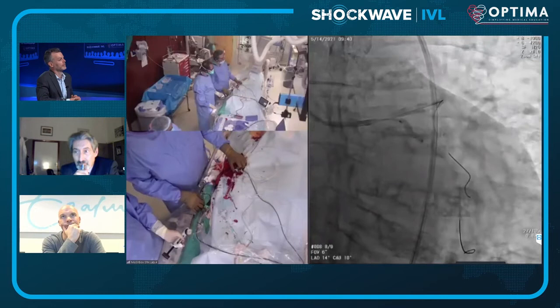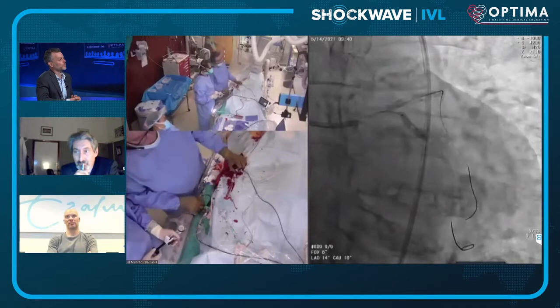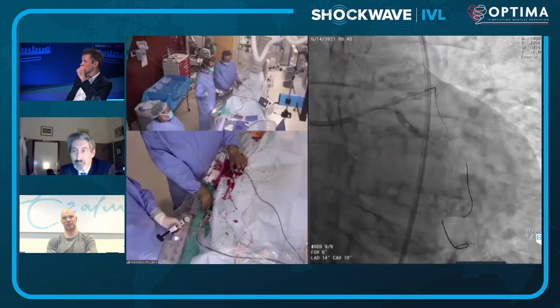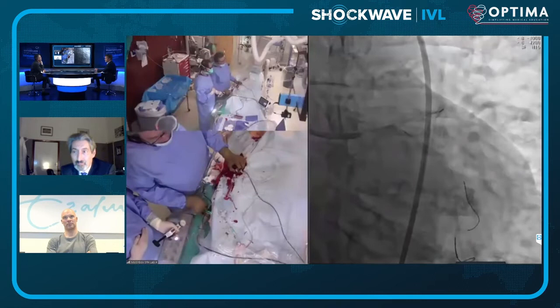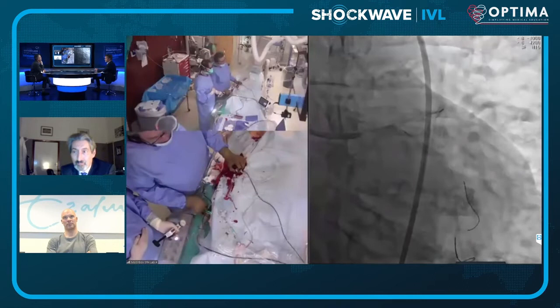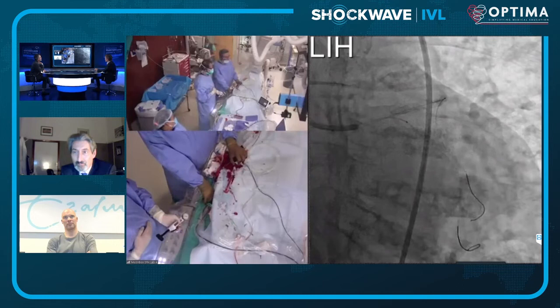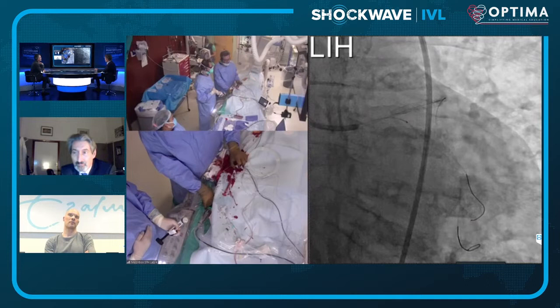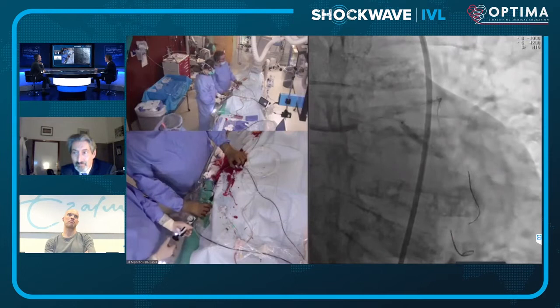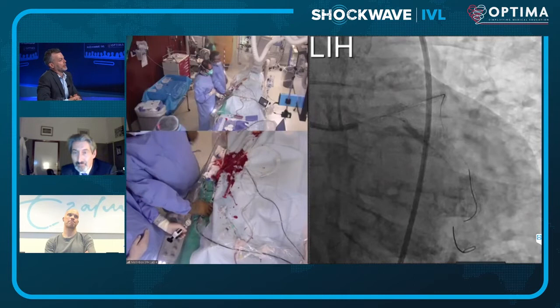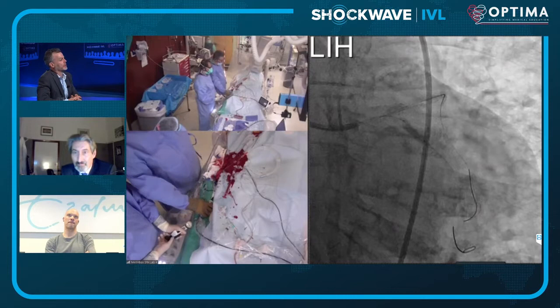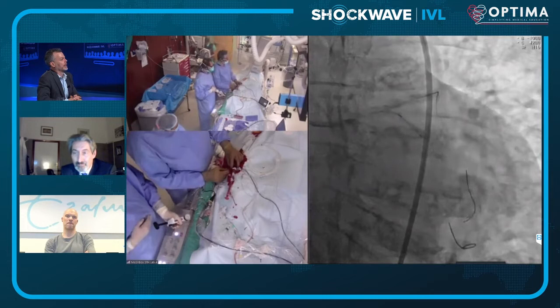Richard plans to do one more shockwave run then move back to the left main — they have 60 pulses remaining. Carlo notes there is a dose dependency: more pulses deliver more fractures. The question about pulse management is whether it's simply about balloon expansion or whether there is a relationship between visible fractures and vascular compliance. Richard also notes the cardiac pacing artifact visible on the monitor — shock pulses causing electrical capture without mechanical capture — which is a known phenomenon described about 18 months ago, sometimes with a slight decrease in systolic pressure, but with no clinical effect in their experience.